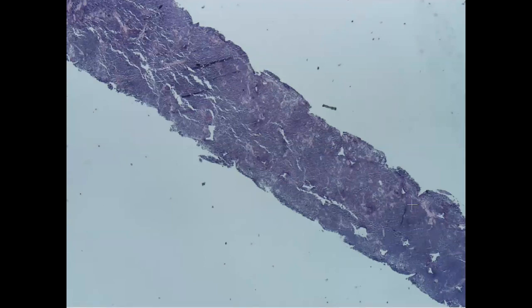But from this power, I can see that we have these monotonous, kind of bluish cells that are infiltrating, or present all over the lymph node. From this low power, it's difficult to detect whether we have any large cells or not, so we will need to go on a higher power, but at least we can say that we don't have any weird appearance. I will go on a higher power.